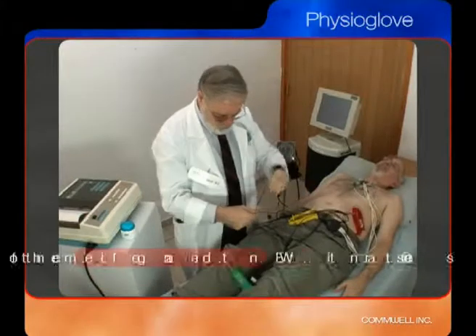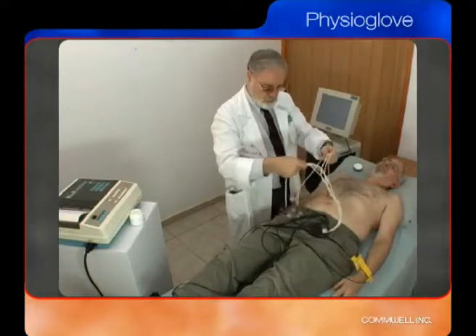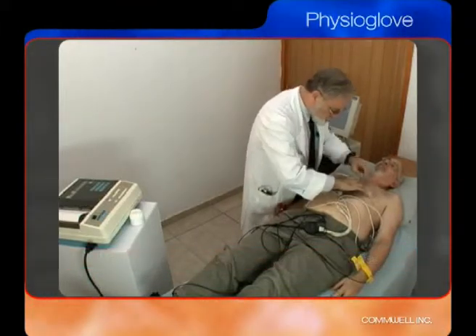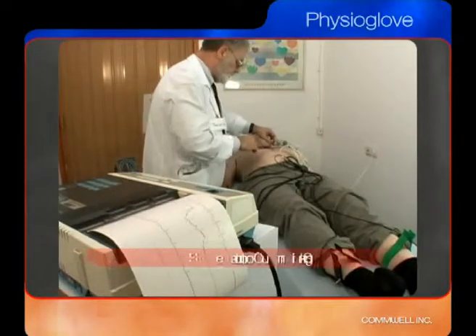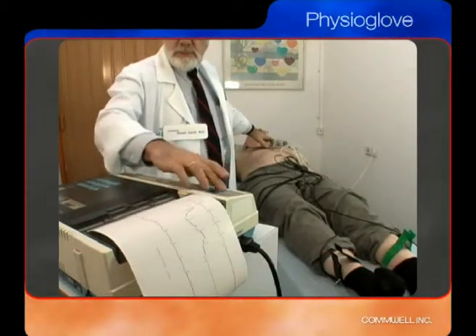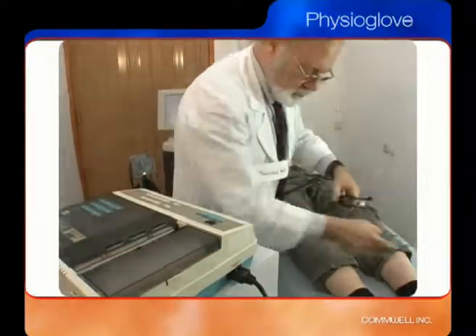It is a process that involves the constant entanglement of the lead wires, the lengthy practice of prepping the skin and placing the electrodes, the difficulties in securing skin contact of the electrodes, and common episodes of improper placement or swapping of electrodes.